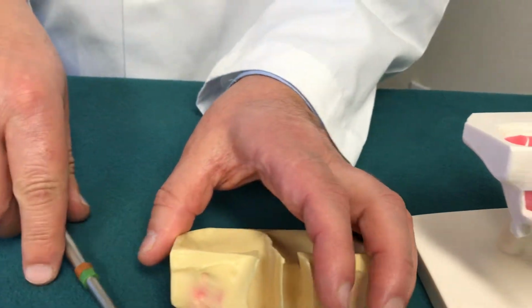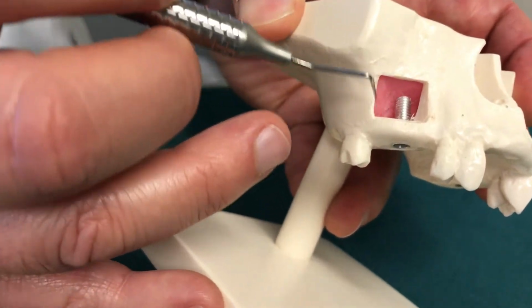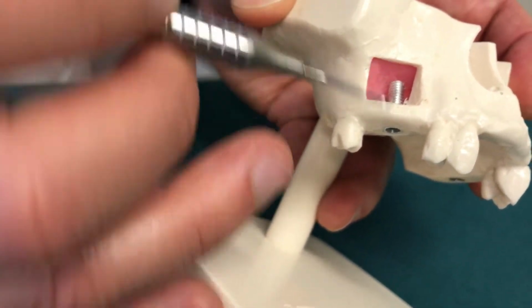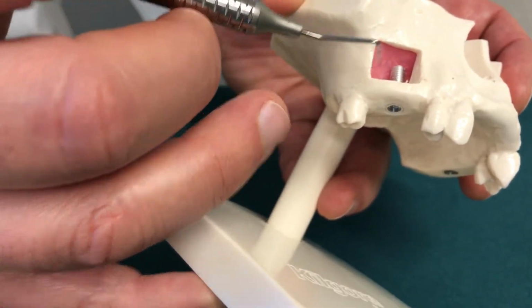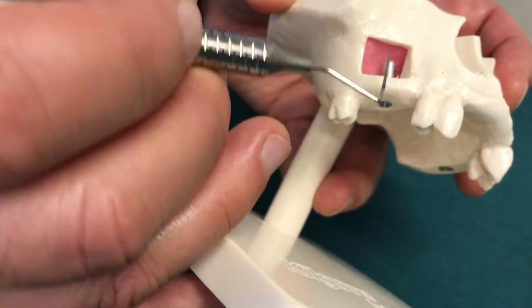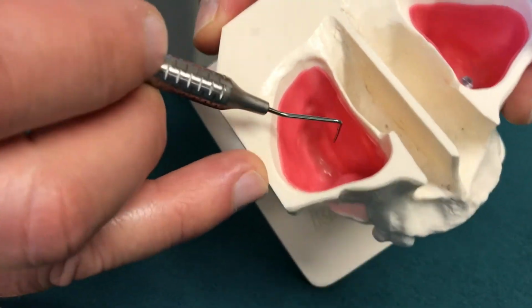Now, I could show it to you on this model too, which is a better one. It shows it a little bit bigger so you can see it better. You see how we removed a lot more bone than we normally do, so you can see the implant within the sinus, and it shows the sac that we created.